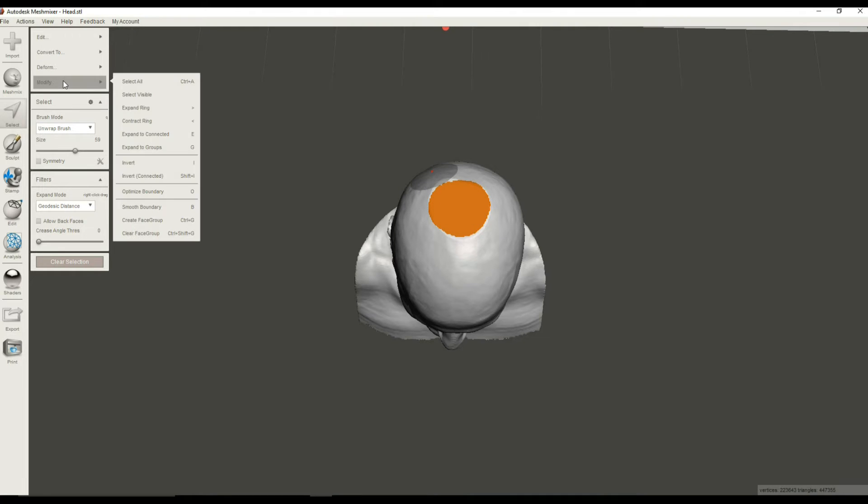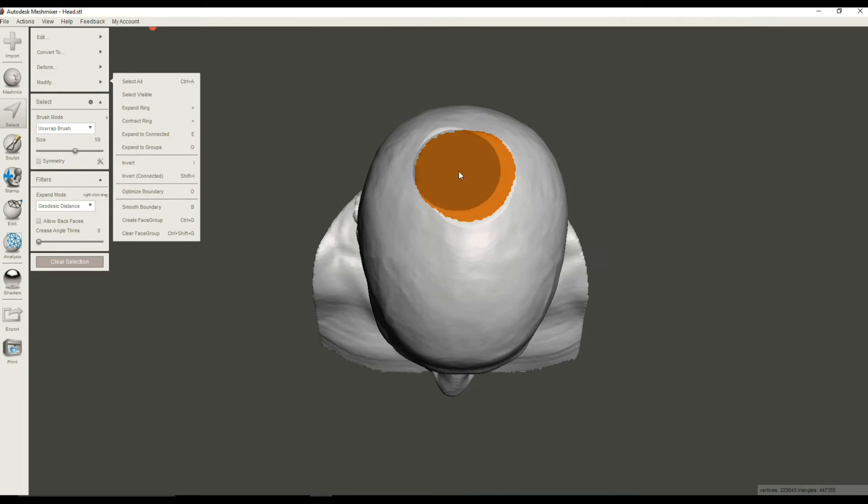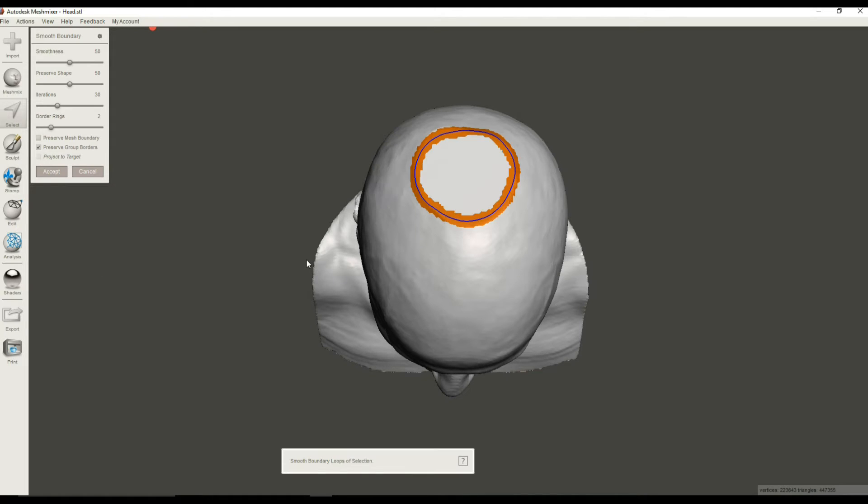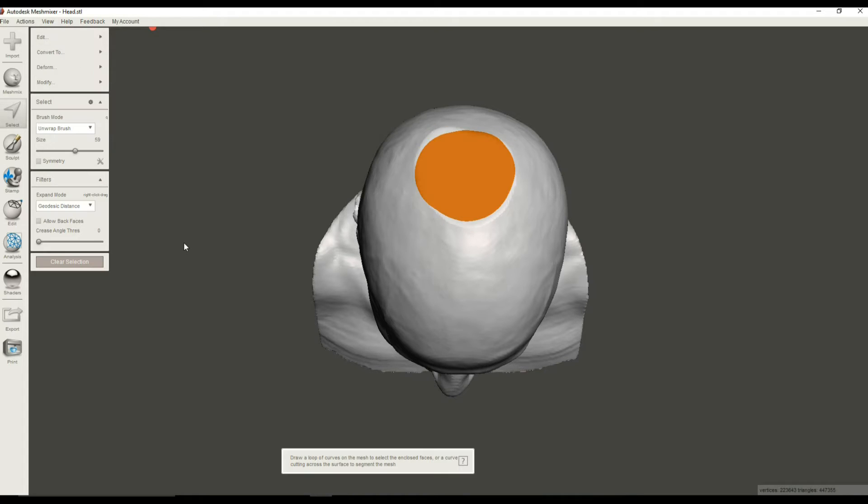Next, we're going to make this selection a little prettier. You can tell that it's a little bit rough on the edges. So you go to Modify, Smooth Boundary, or hit the B key. All right, and that looks pretty good. I like that, so I'm going to hit Accept, and now I've got a highlighted region with a nice smooth boundary.